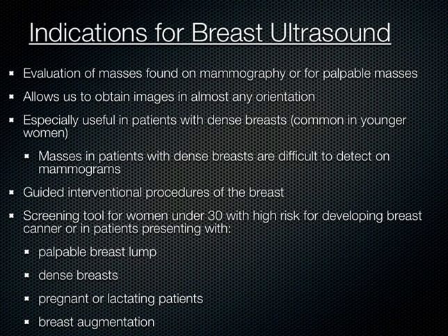First of all, anytime somebody has a mass that was found either through palpating their own breast, or a physician palpates their breast, or it was found on a screening mammography, this is another way to evaluate that mass, as you will see. And one of the advantages of ultrasound allows us to basically scan in any orientation we want, and to get a really good three-dimensional image in our mind, we may need to move that probe in many different planes in order to do that.